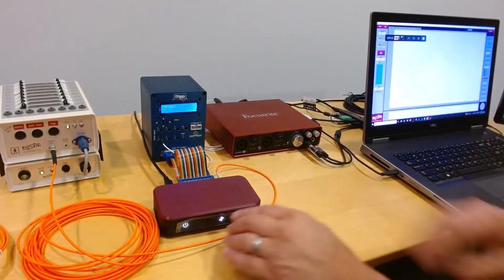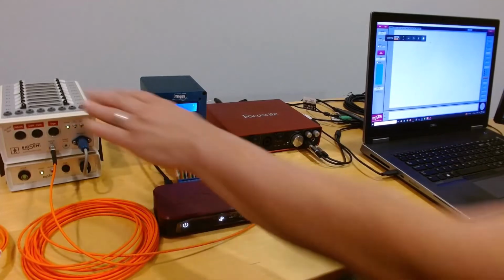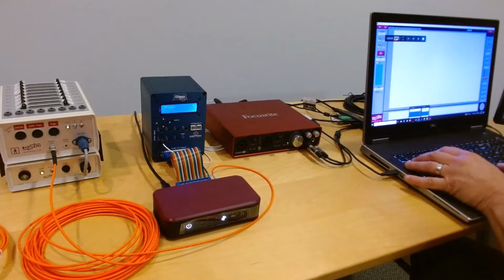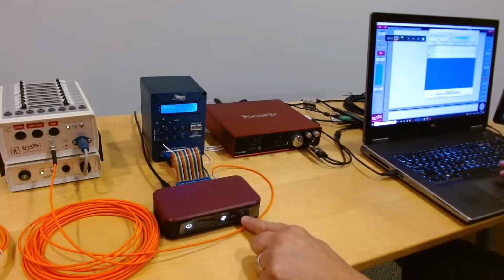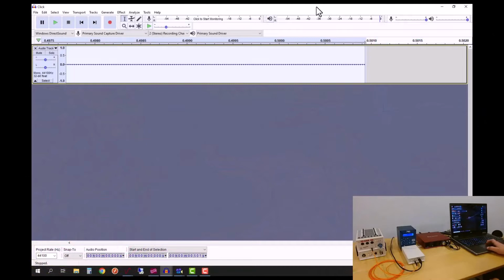And we should see then an indication on the front panel of the receiver that the clock is being received along with data from the EEG device. And then when I send a trigger bit or an event to Triggy, that sound is acknowledged by Triggy, but it's also seen here as a trigger bit on the front panel of the Biosemi interface.